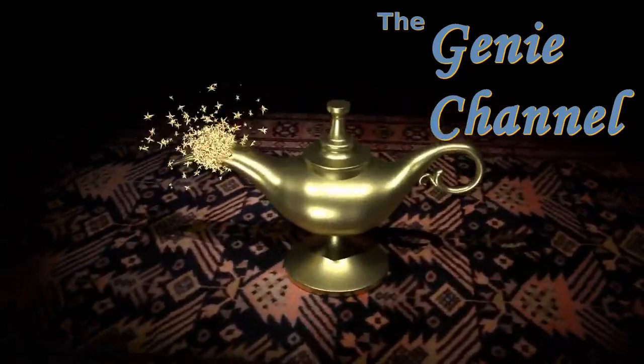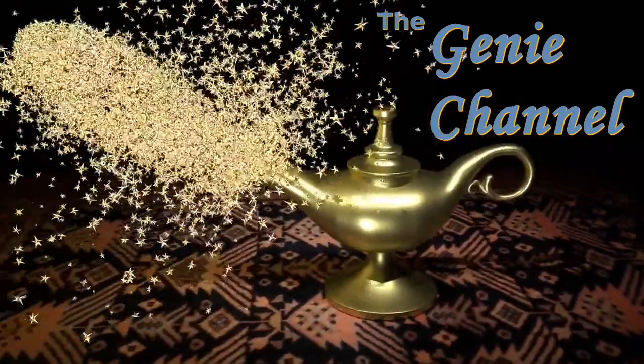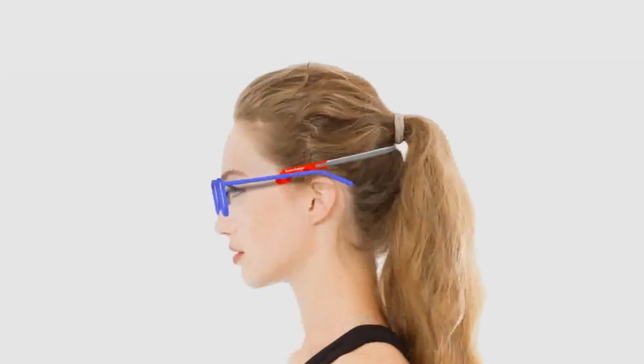Hello everyone. So you've had surgery done to your nose, or you're about to have it done, and you're wondering about how to wear glasses after rhinoplasty. Well, here's the ideal solution — this is the Spexty Light. Fitted correctly, the Spexty Light will hold your glasses off your nose for as long as you need for your nose to heal after rhinoplasty.